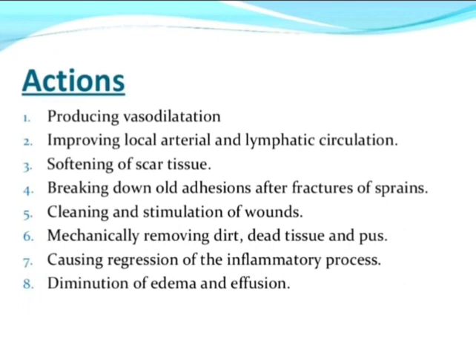There will be softening of scar tissue, breaking down of old adhesions, and cleaning and stimulation of wounds, mechanically removing the dirt, dead tissue and pus in the wounds, which is mainly how debridement is done, and causing regression of the inflammatory process, and there will be reduction in the edema or effusion.